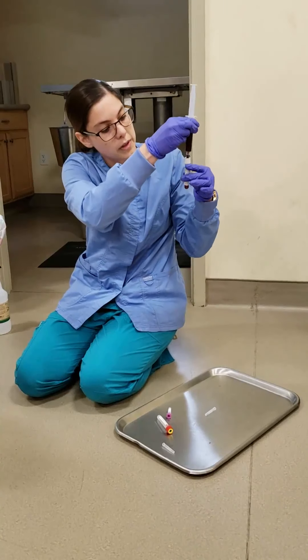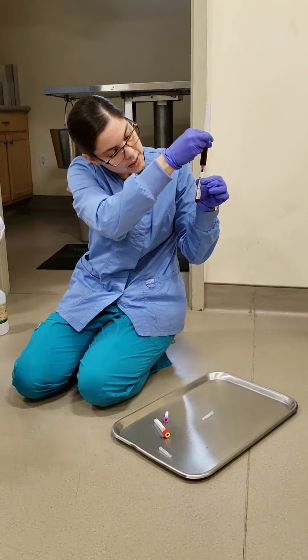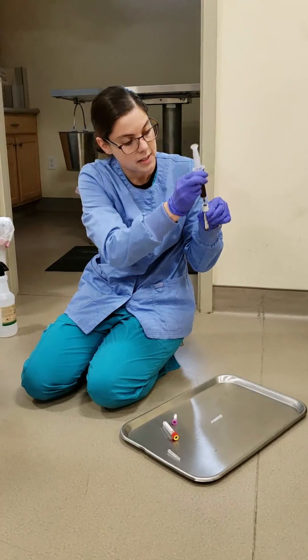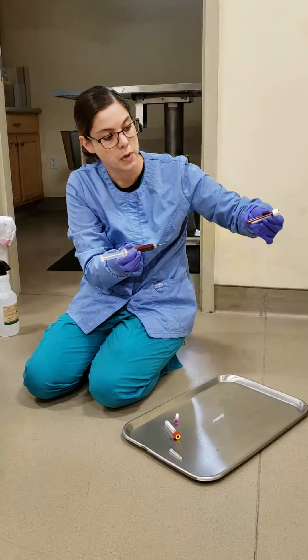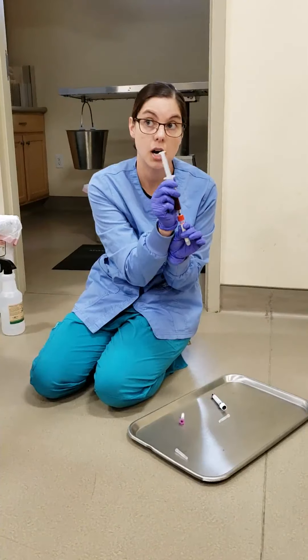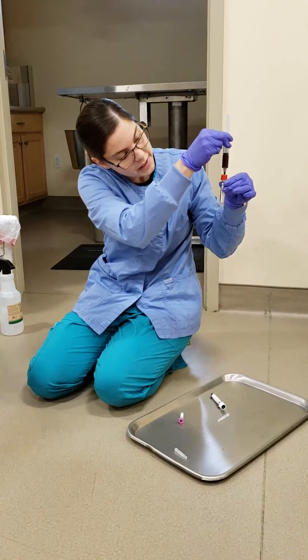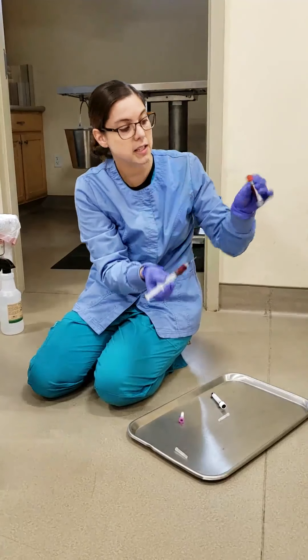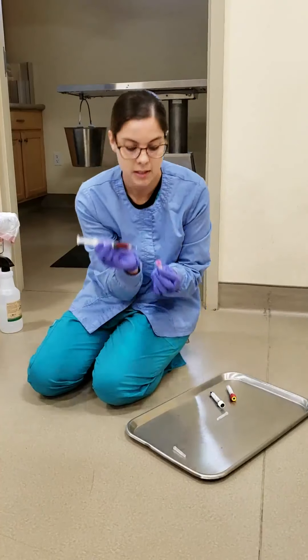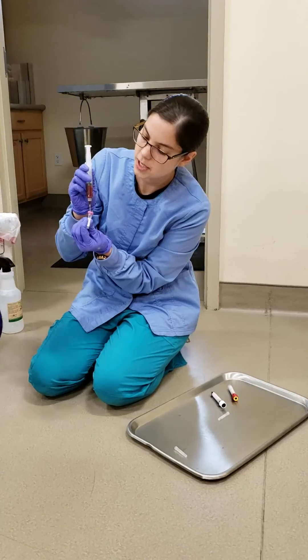We start with our non-additive — 90% of the way to that line. We want to invert it. Then we want to do our serum separator tube, making sure we're filling it to that line, and again we want to invert it. Then into our small lavender top tube.